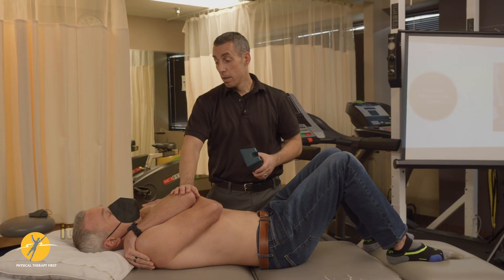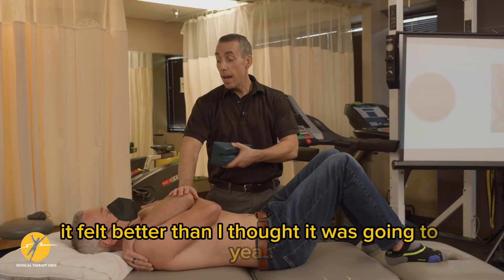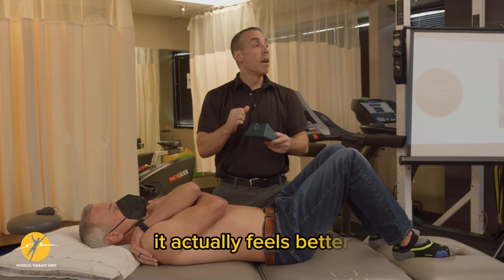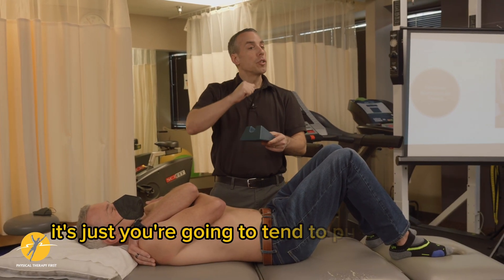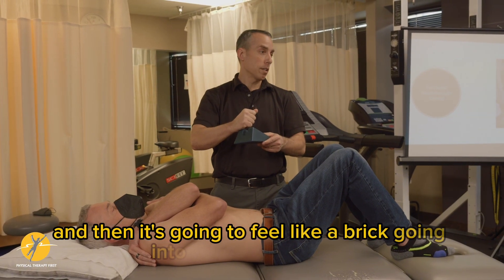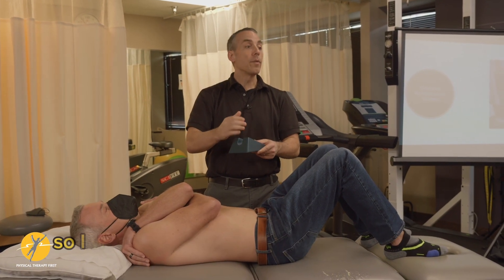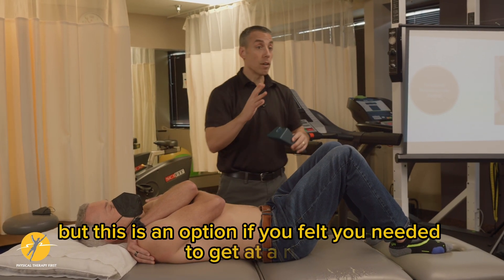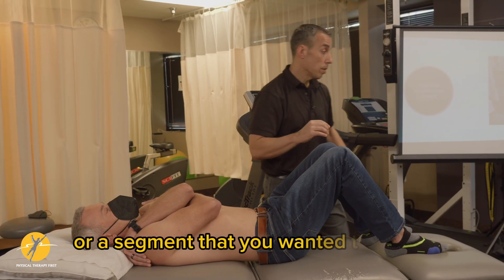Did that feel okay? It felt better than I thought it was going to. And that's what most people say — it actually feels better. It's just that you're going to tend to put too much force on it, and then it's going to feel like a brick going into the patient's back. So I would do the towel one first before that, but this is an option if you felt you needed to get at a ring or a segment that you wanted to adjust.